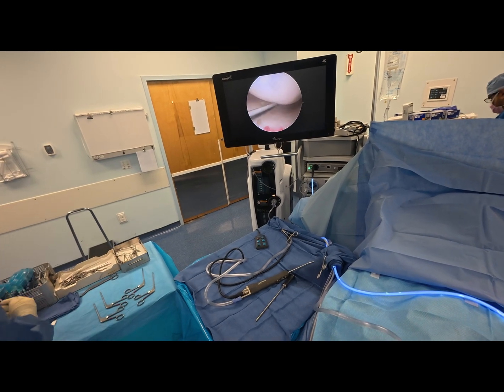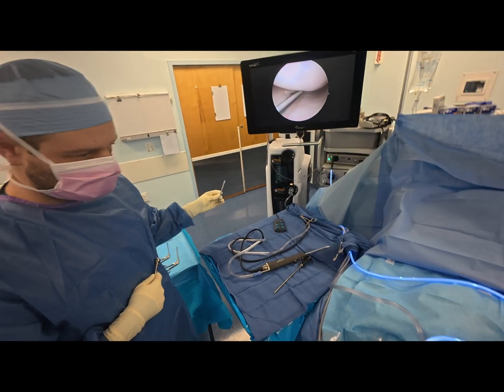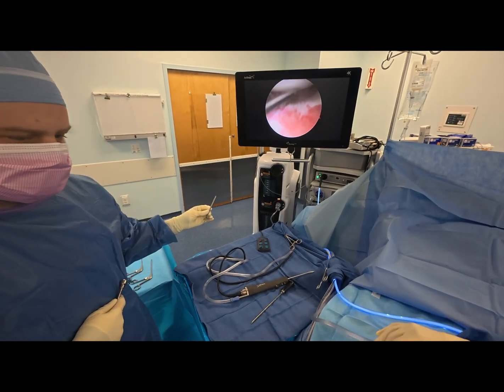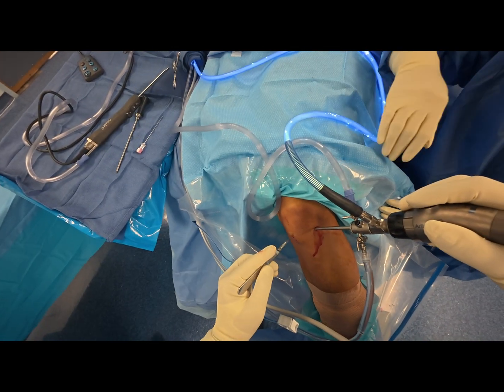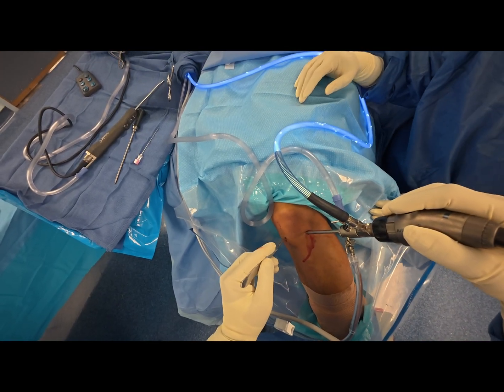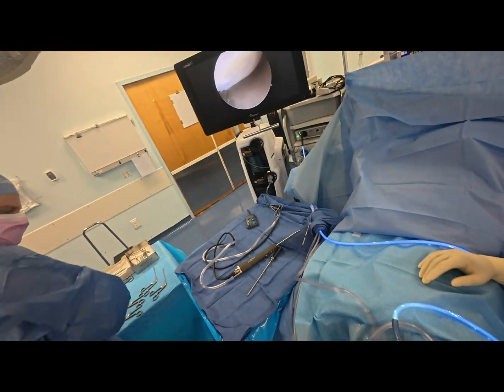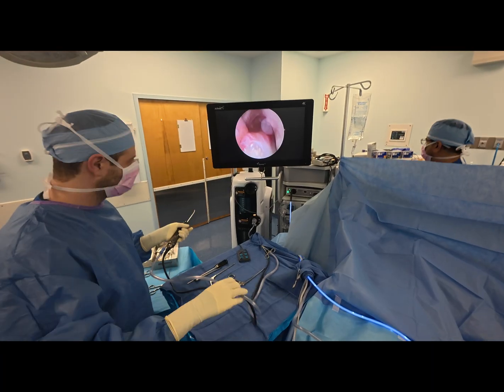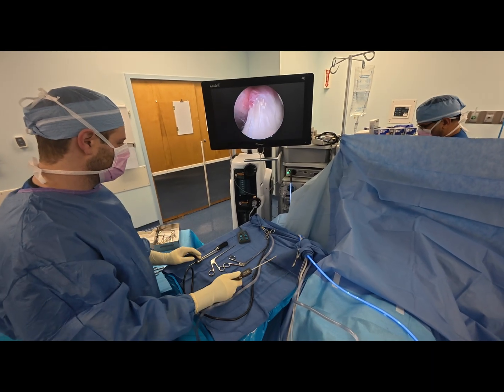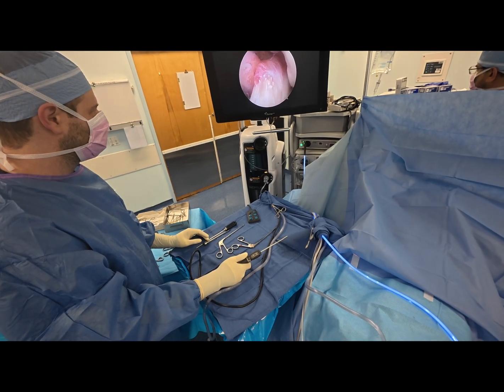so there's my trajectory with the 18 gauge spinal needle getting into the joint, making sure I can evaluate that area. 11 blade. But on the preoperative MRI that I reviewed just before the surgery, I saw a probable recurrent tear at the junction of the posterior horn and body. There's the anterior cruciate ligament, nicely intact. Looks like he's had some cortisone injections in the past.